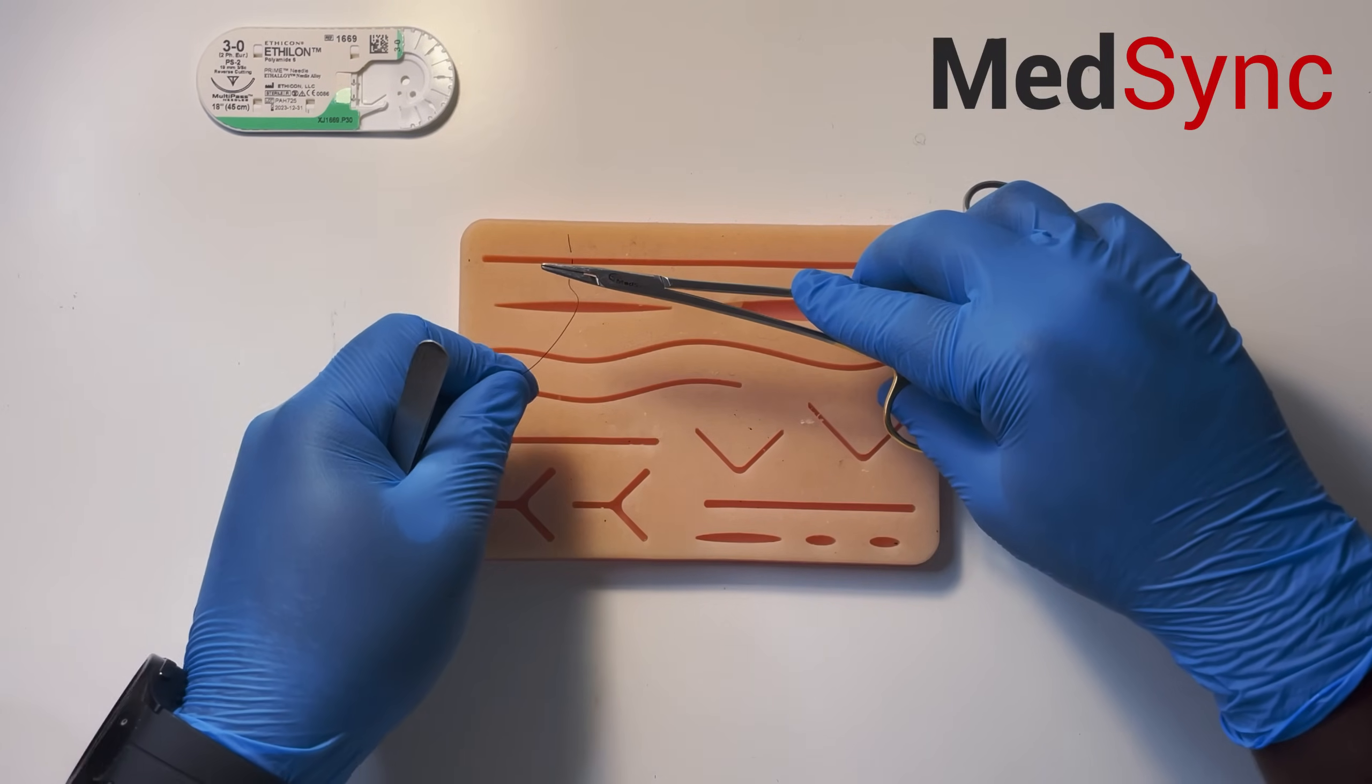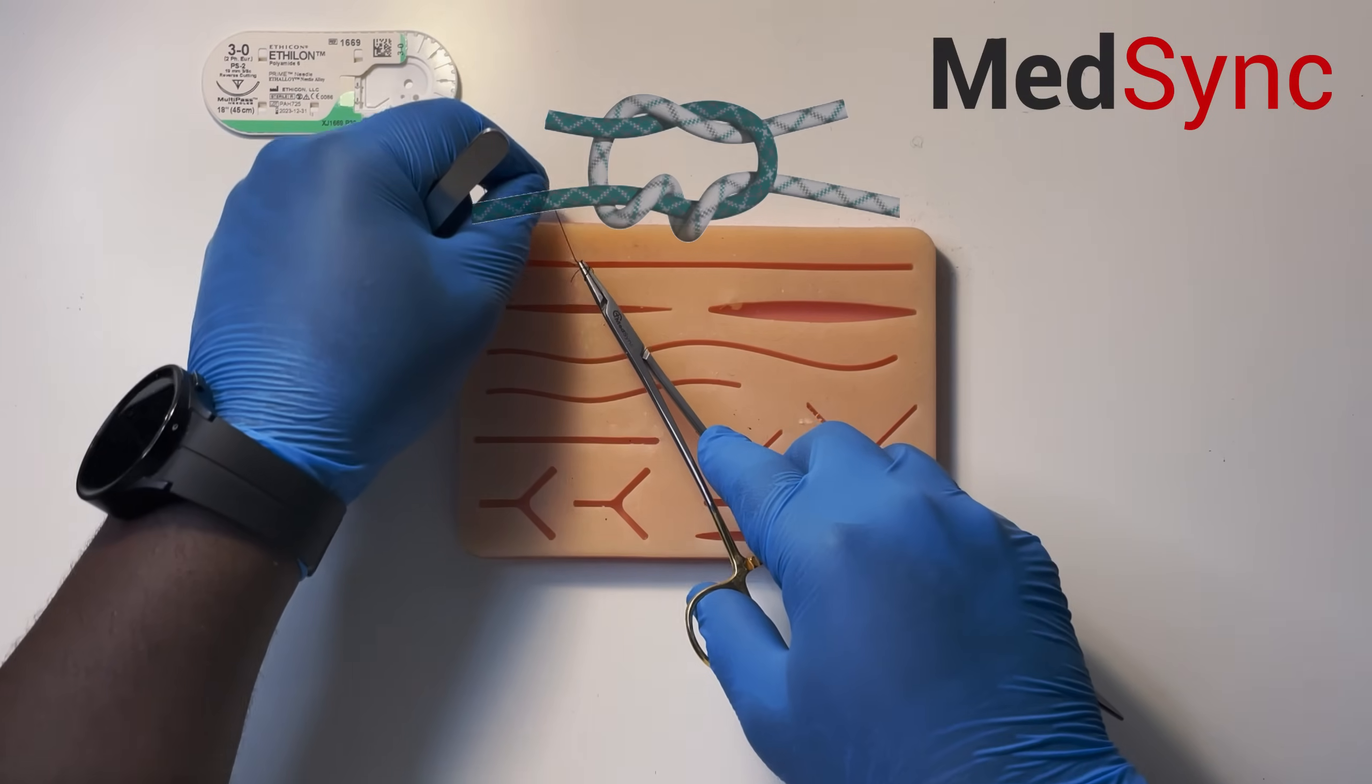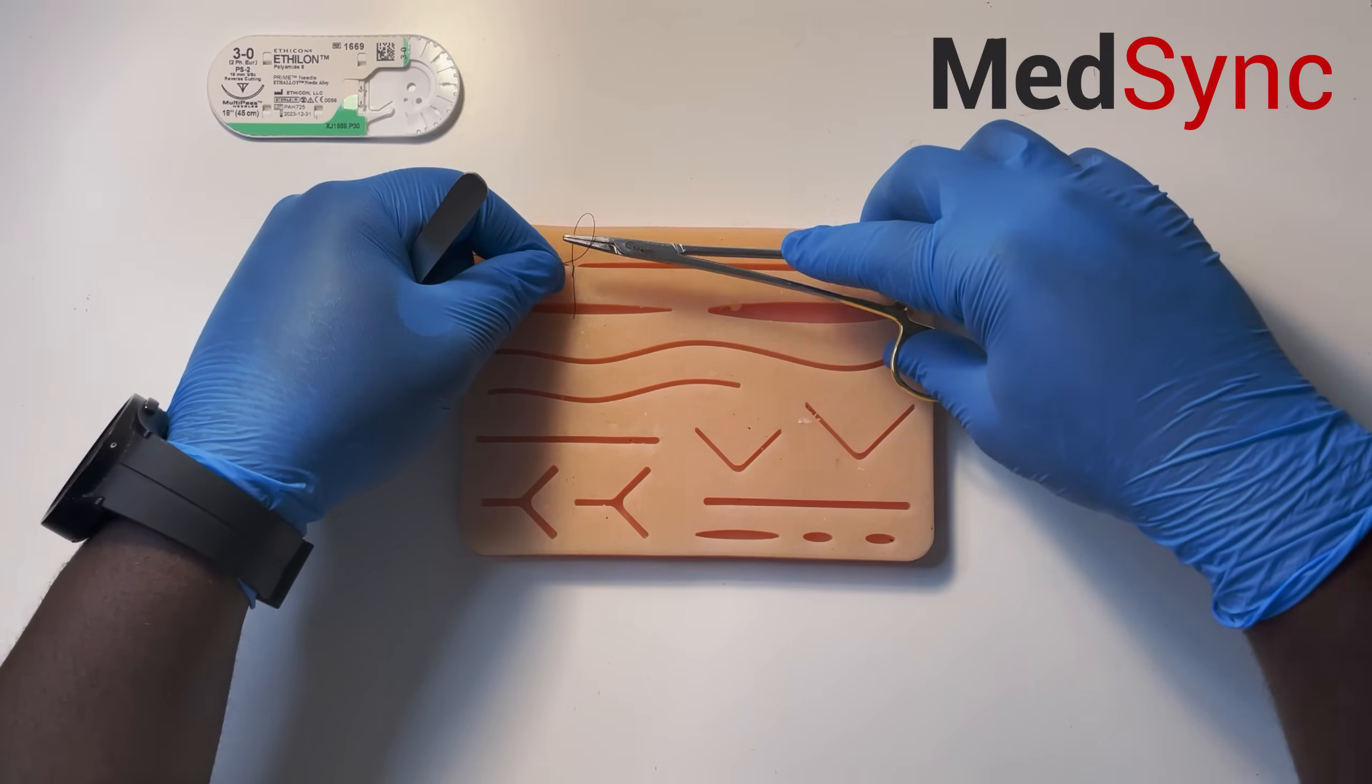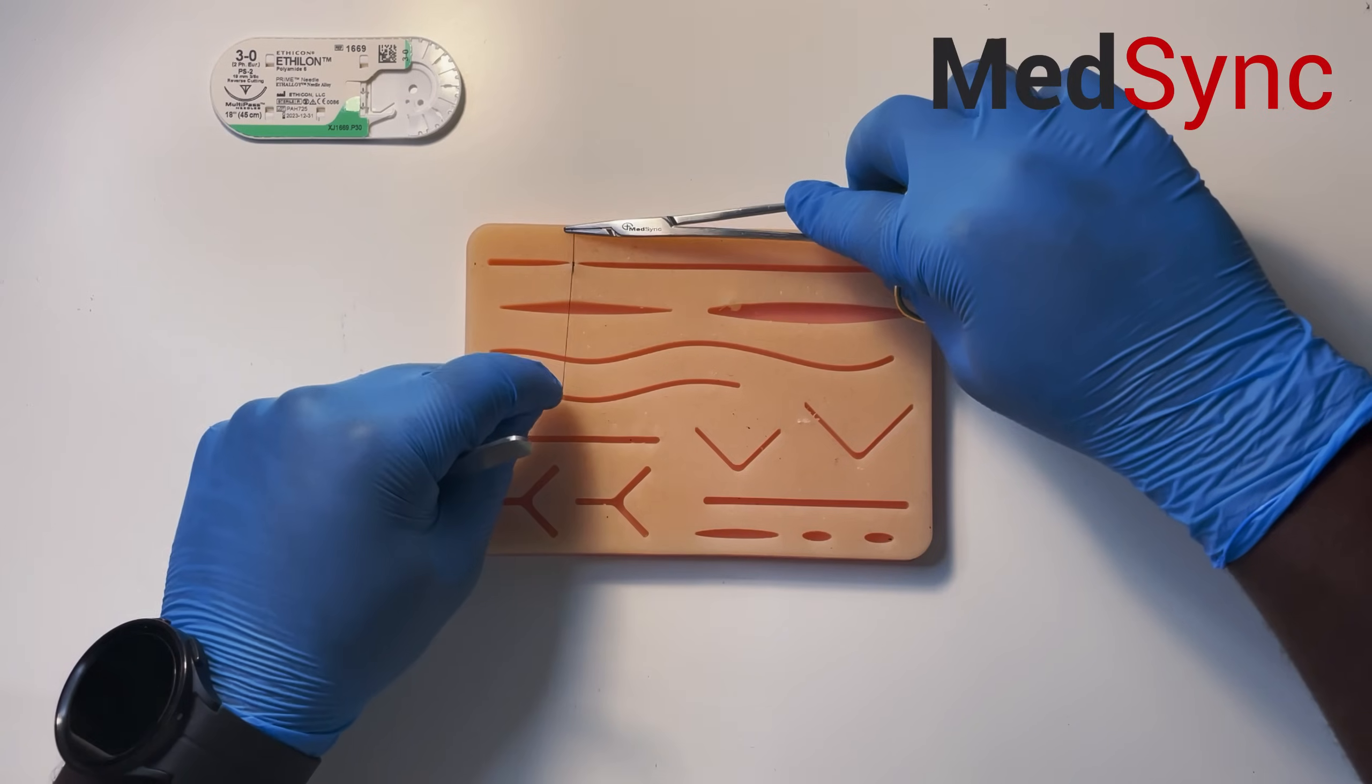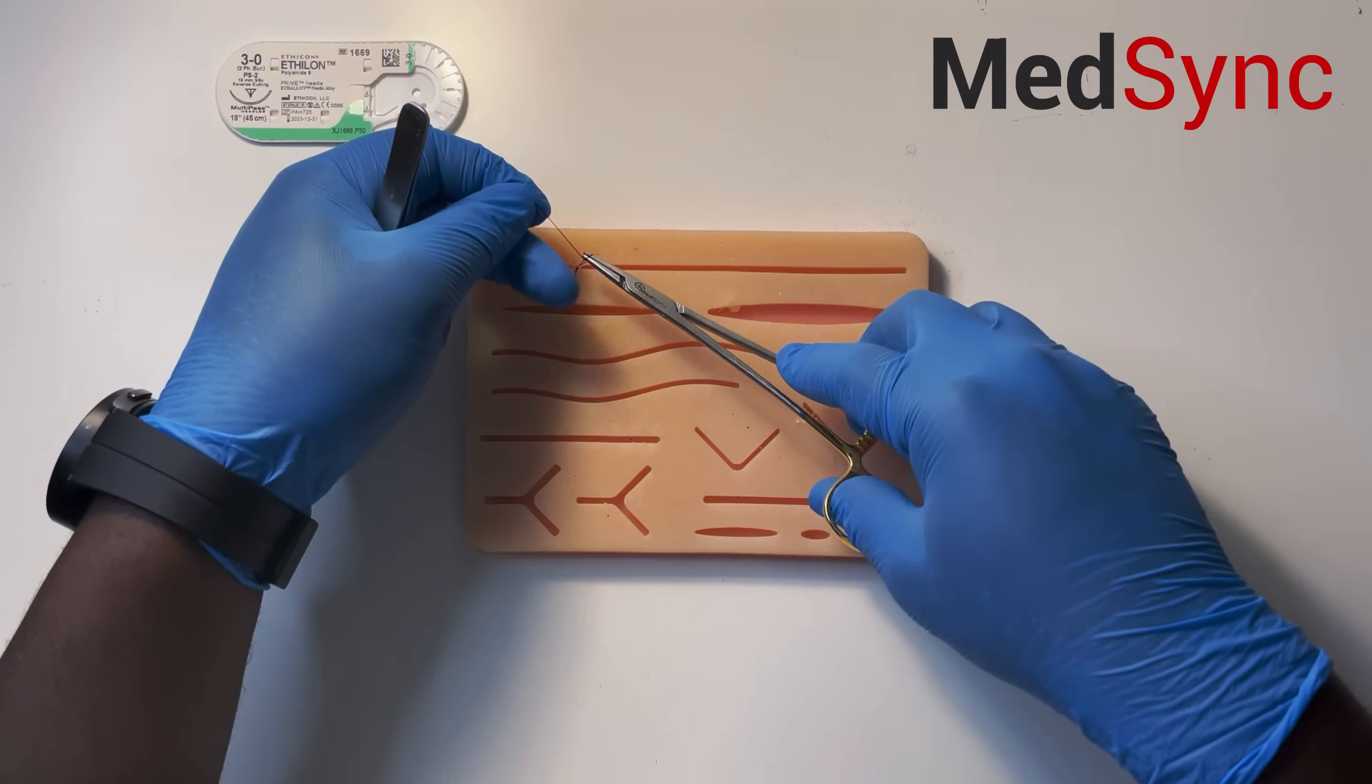Wrap the suture just around the tip of the needle holder by pushing forward for your surgeon's knot and tie. You pull it forward - it makes the loop for you. Put the needle holder in between, grab the short end at the tip, and alternate. One more time: push it forward, it creates the loop and tie.